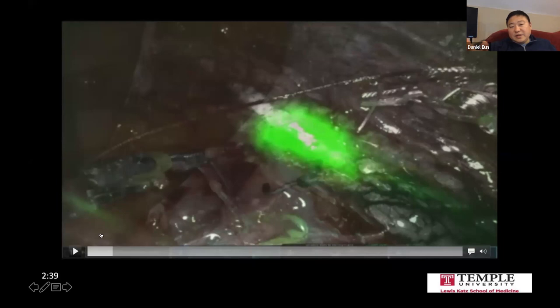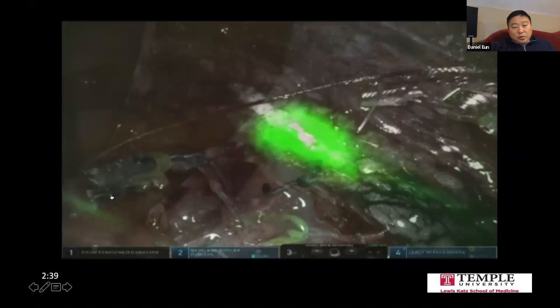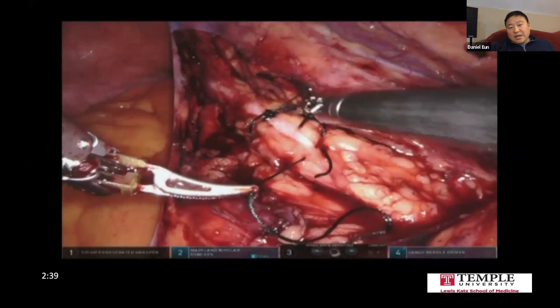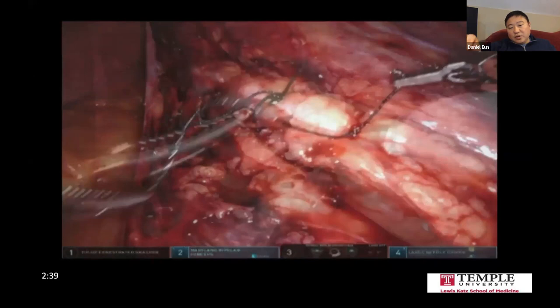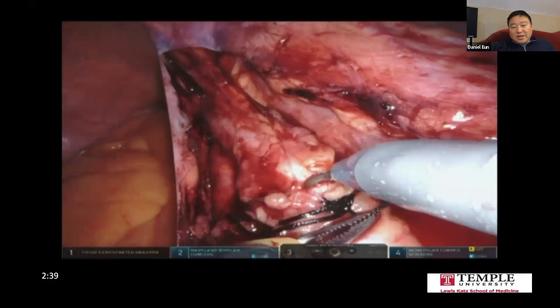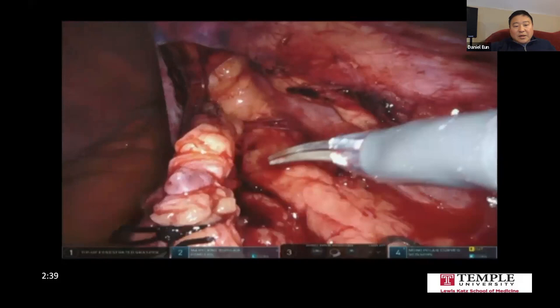This is the third example of how to use near-infrared. It's using a white light scope. And so there's a ureteroscope here. And it's important in this case that we identify exactly the location of this ureteral tumor. So under visualization, my resident's got a scope in there, and I passed a needle through into the lumen of the ureter to identify exactly above and below the ureteral tumor. So here, once we've tied it off, you really don't want to take any more excess ureter because you want to try to keep the ureter segment that we're cutting off as small as possible. And so here we're going to cut off the ends of the ureter.